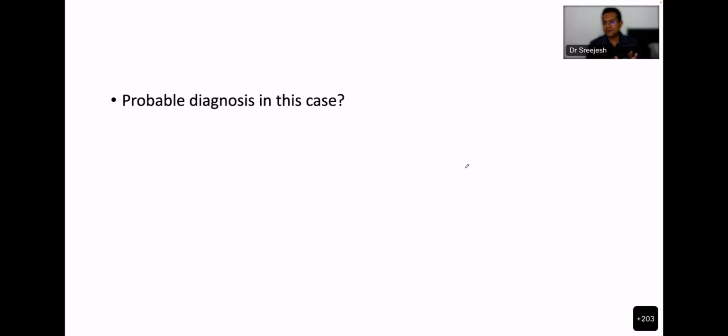Do you have evidence that they are clonal? No. It looks like it's an amyloid. I think you should restrict that this is likely to be an amyloidosis. Amyloid. And since there is a plasmacytosis, it is likely to be primary amyloidosis. Okay, you have to restrict your impression to this much. Don't just say light chain amyloidosis. There is no evidence in the images to say that even it's a myeloma. So you don't have evidence for that. It looks like amyloidosis. Since there's a plasmacytosis, it may be a case of primary amyloidosis, but we need to investigate further.